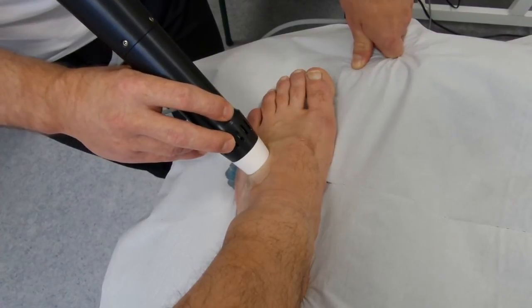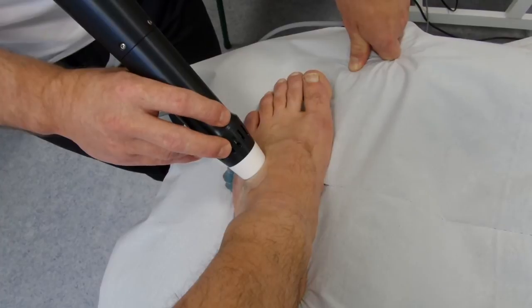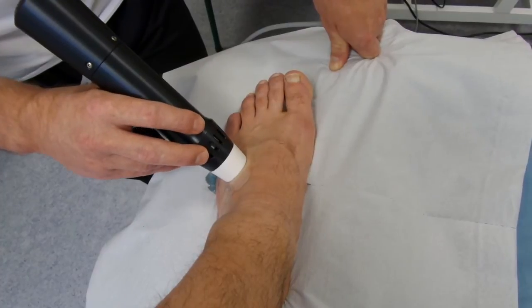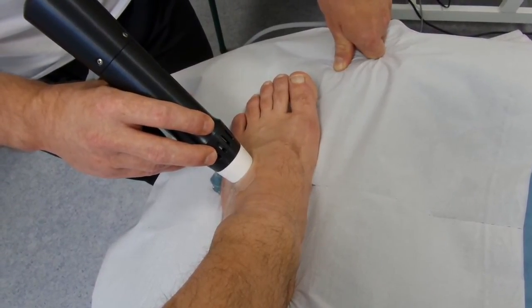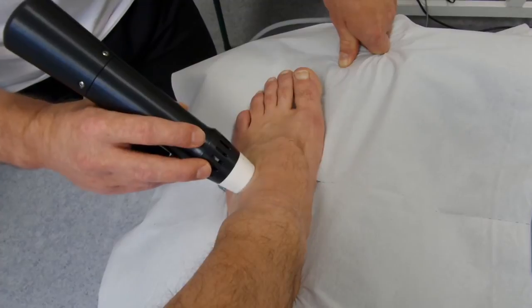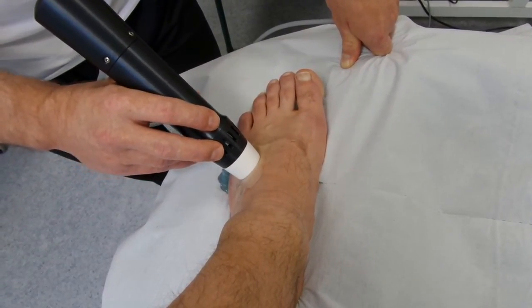The last set of treatment on this patient was to hold the problem at bay whilst he competed in a strongman competition, in which he actually came second. We're now trying to address the problem properly, because obviously we wouldn't want to shockwave the area and then send him out doing heavy carries — you're not supposed to do heavy impact loading activity after shockwave, particularly in the lower limb.